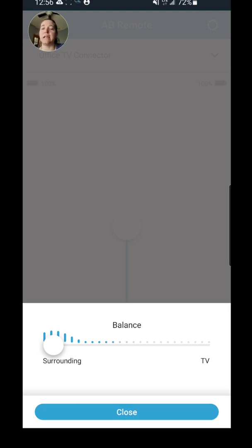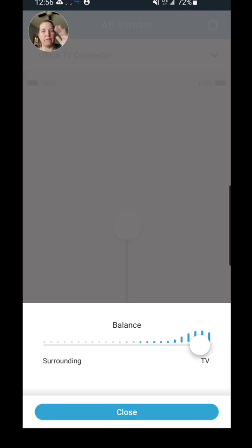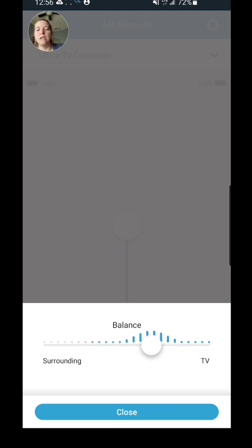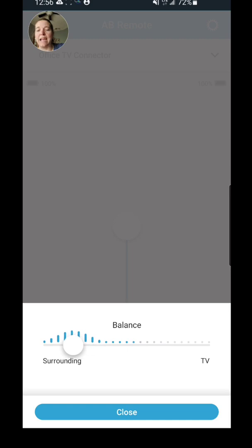But let's say it's a really noisy environment and I don't want to hear what's happening around me. I can slide this back the other way and now I'm hearing almost completely the TV Connector. I can still hear a tiny, tiny, tiny bit of environmental sounds, but it's very limited. And so you can really, really fine-tune this with the app anywhere in between and you find your balance that you like.